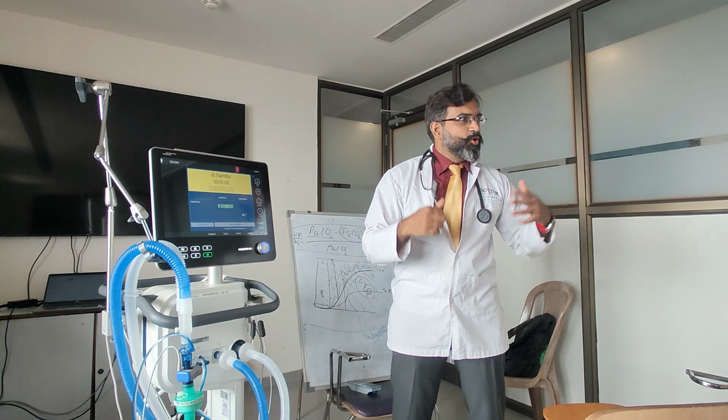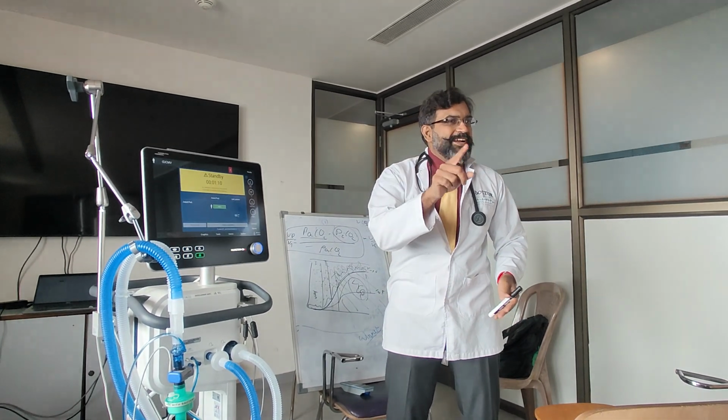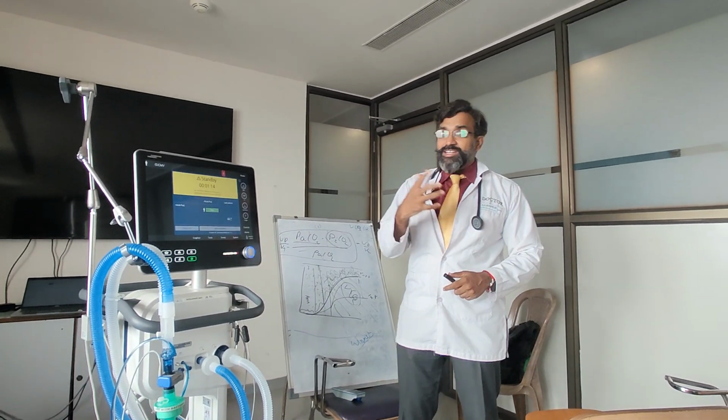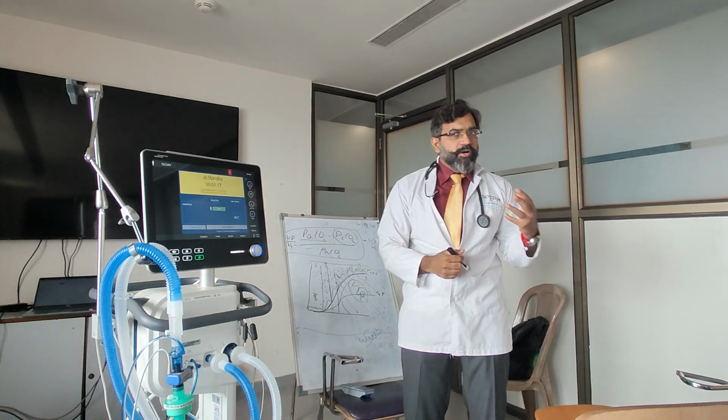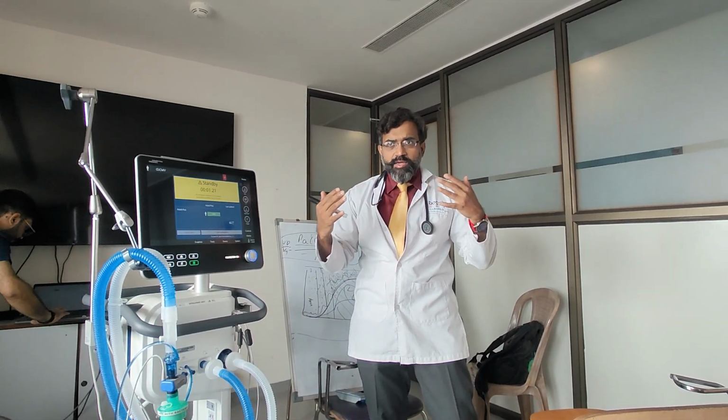It didn't have a main name. It is no mode, which means you don't have a mode in it. You just have one button that you have to press. This is what was told to us. There was only one button. So it was very interesting because you are moving from a very important way of ventilation to a very different way of ventilation. What is the difference between ASV and this?